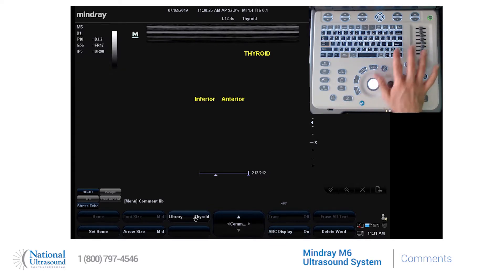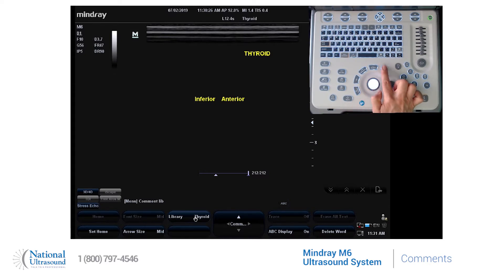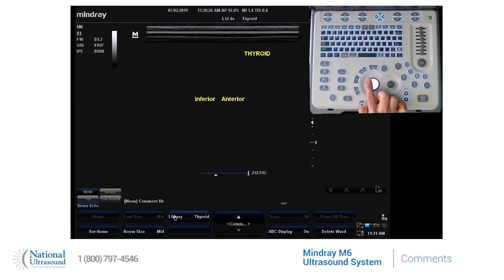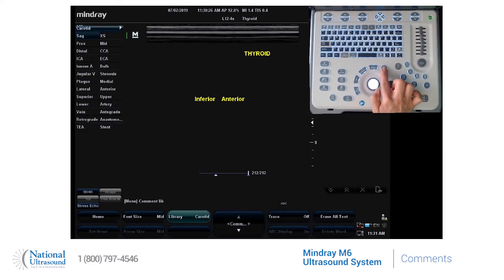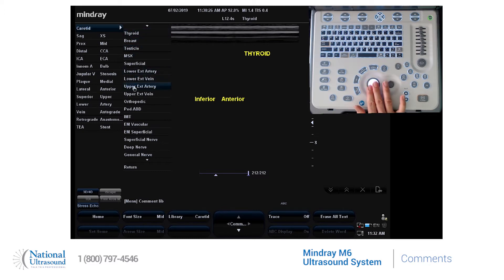If the menu is not on the screen and you would like the menu to appear, you can click on the library tab. At the top, you'll notice you can choose different libraries based upon presets.